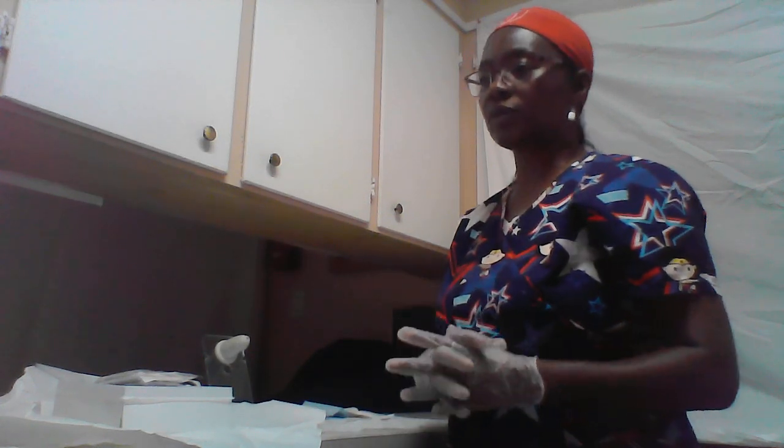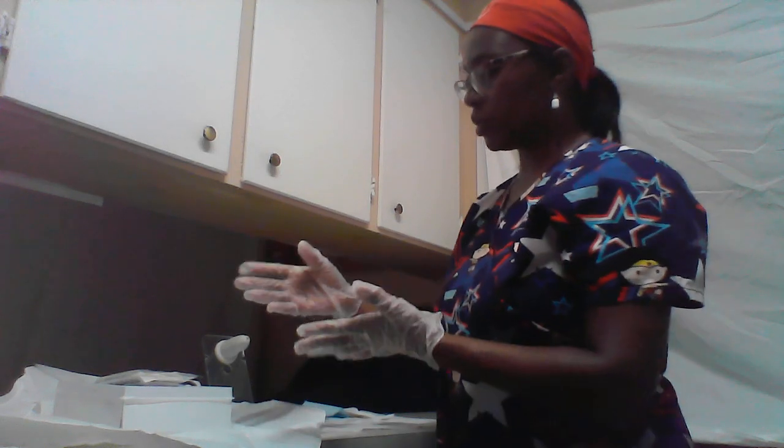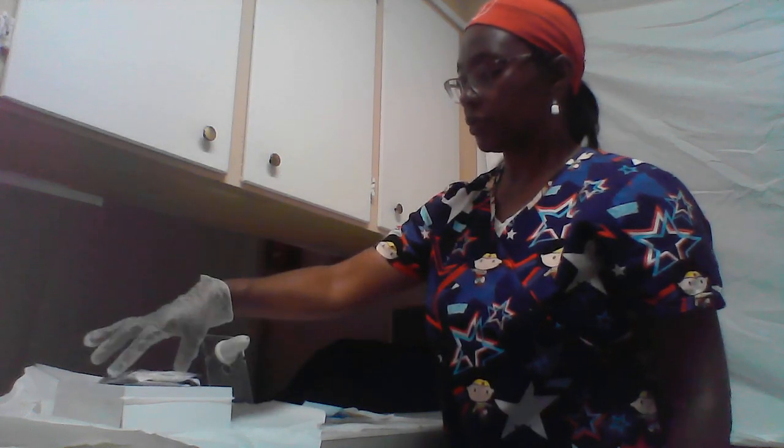I'm going to take out the drape. This is going to go under the patient. And this is for the female, but I'm doing the male. Now I'm going to remove my clean gloves, gel, or wash my hands again, and now I'm going to get out the sterile gloves.